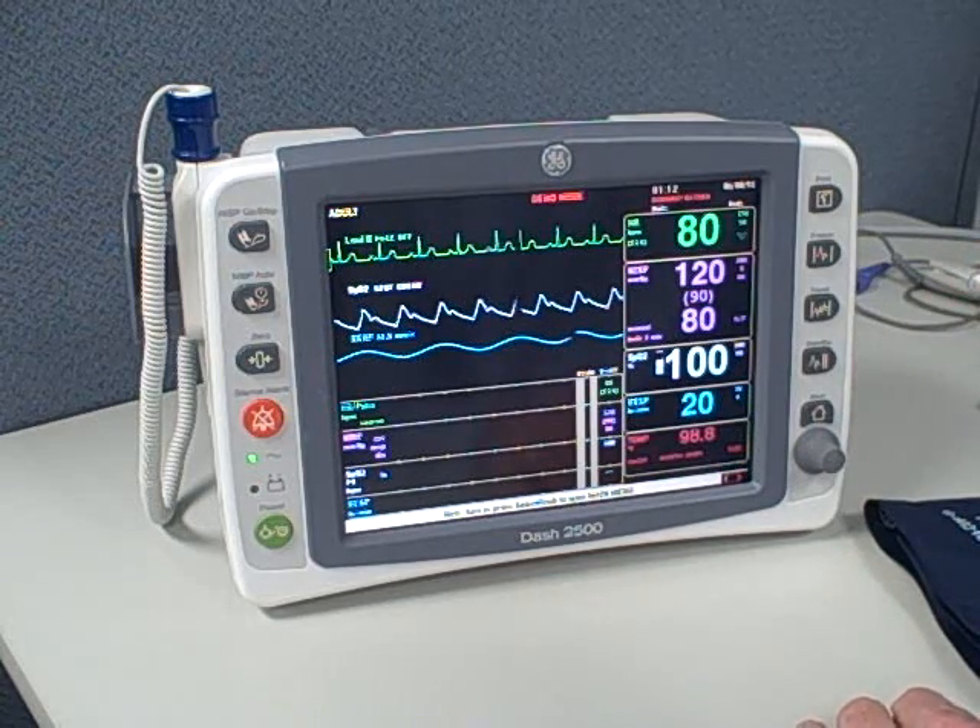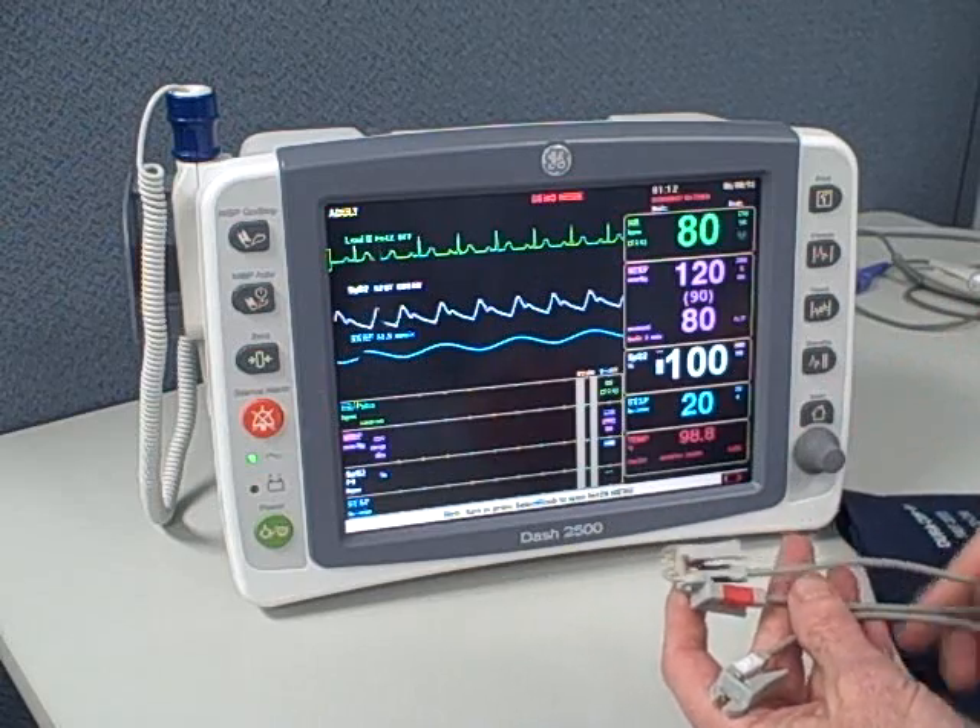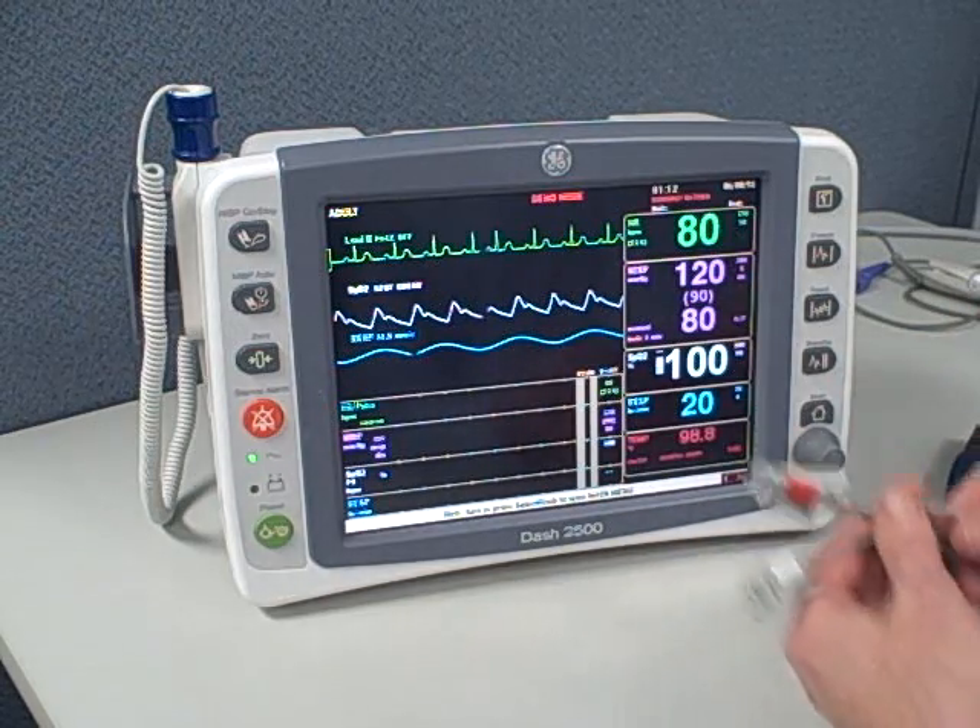The ECG cable is a three-lead cable with pinch clamps at the end, for use with snap electrodes.